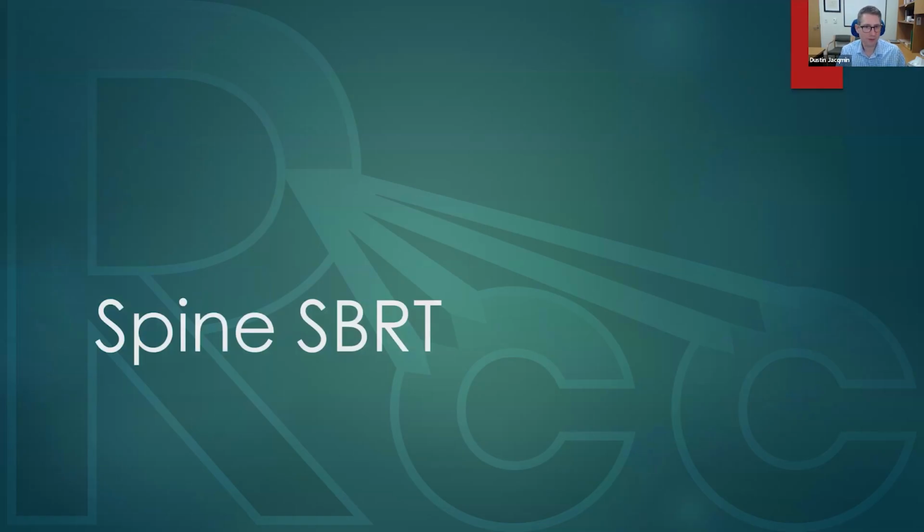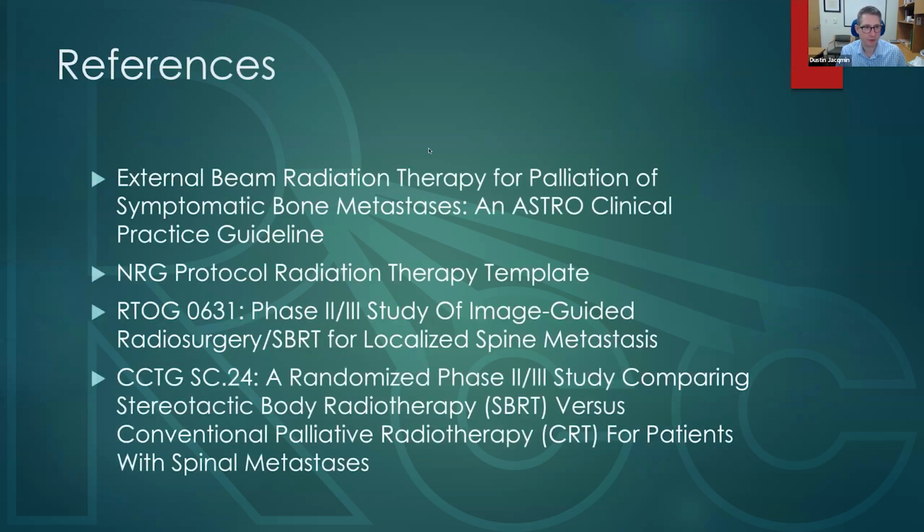All right, let's transition to spine SBRT. I have a number of references here that I use to generate the content. I just wanted to share these with you. The first is an ASTRO clinical guideline on bone metastases. This covers both palliative radiotherapy and spine SBRT. It's a really nice resource. They actually just republished it. They just updated it for the first time in 5 years, so it's really a nice resource.